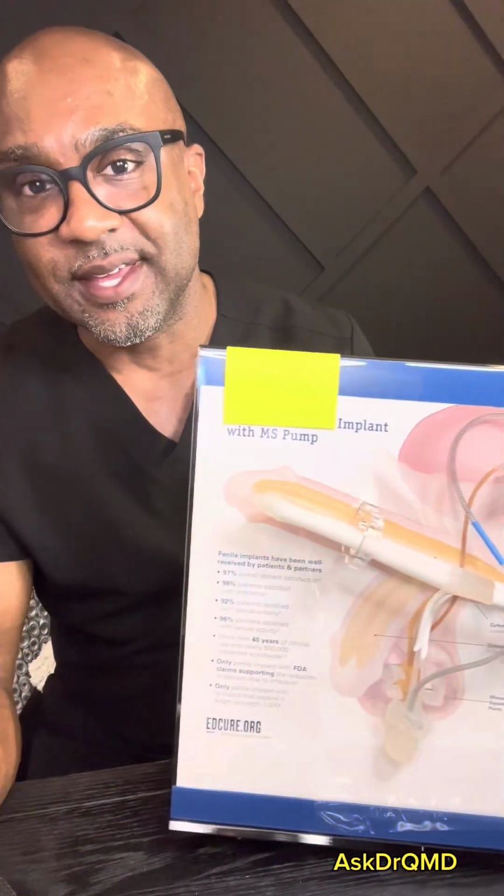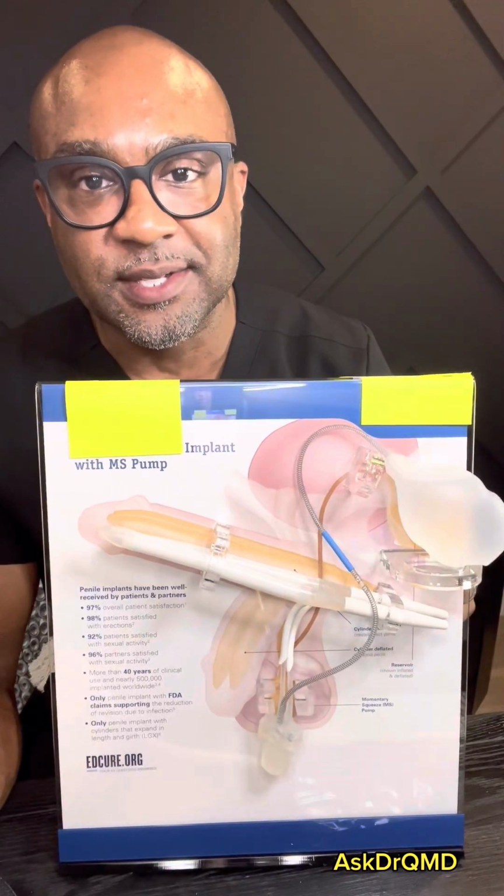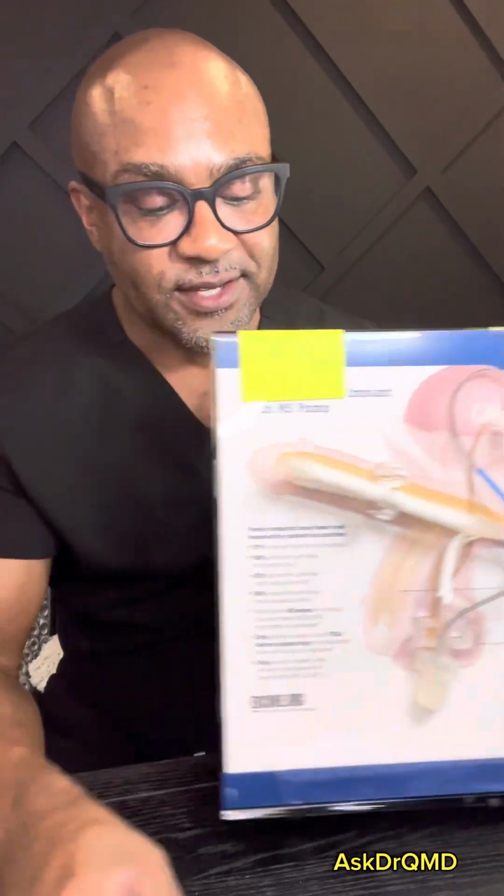So that's the prostheses world in a nutshell. Again, to review, you have the 3-piece, or the Cadillac, as we call it, with all 3 components. This is probably the most favorable prosthetic. If you can't have this, then you can do a two-piece prosthetic, which is also very satisfactory. And if all else fails, you can have a malleable. So that is my 2 cents on penile prostheses.